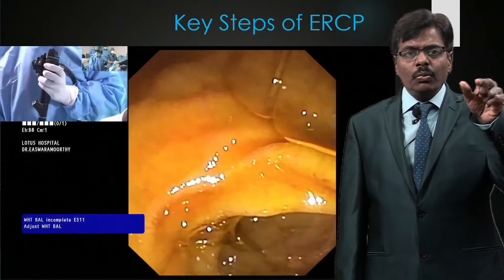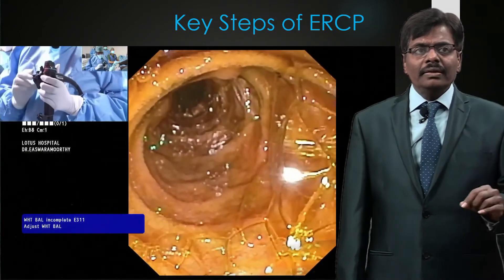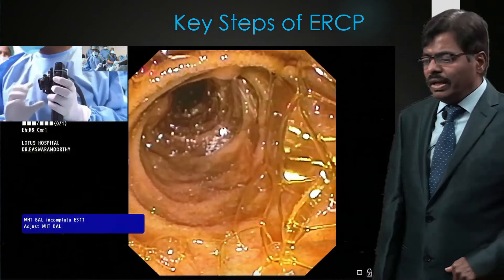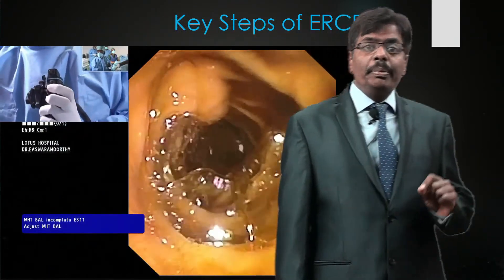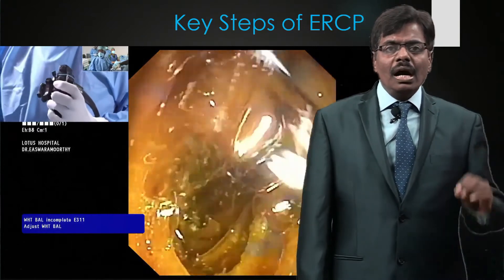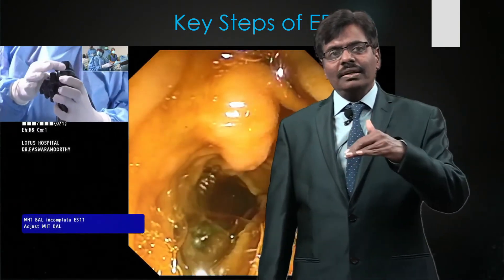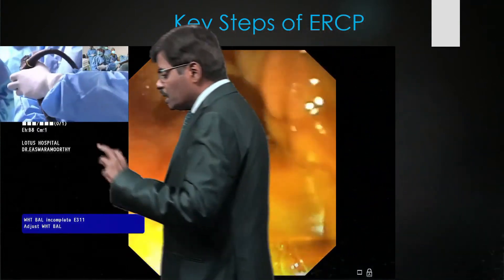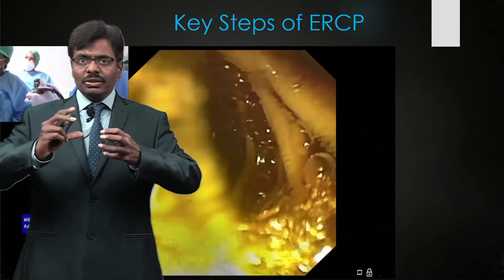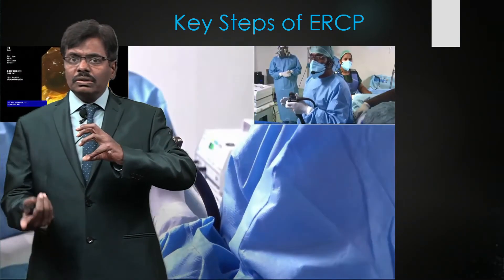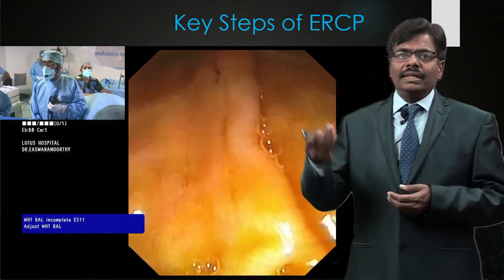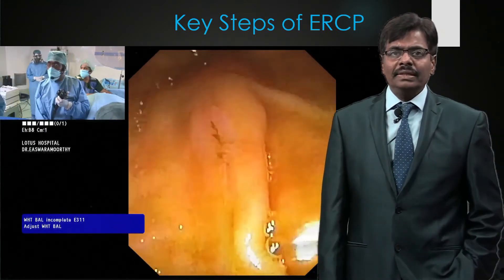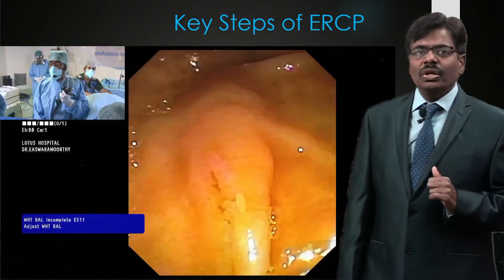We have just entered the pylorus, going from D1 to D2 at the superior duodenal angle. I lock the small wheel — turning it away from me — then push the scope further beyond the ampulla to the D2-D3 junction. Then I turn the small wheel away and big wheel fully towards me so it goes upward. I then pull the scope so it hugs the lesser curve and shortens — now the ampulla is nicely seen as a longitudinal fold with a small slit-like papilla at the top.